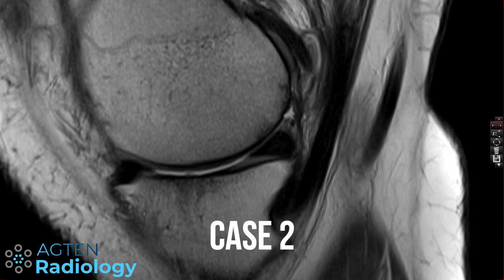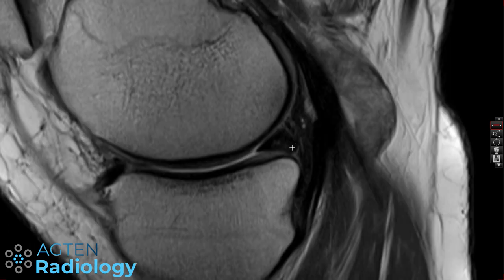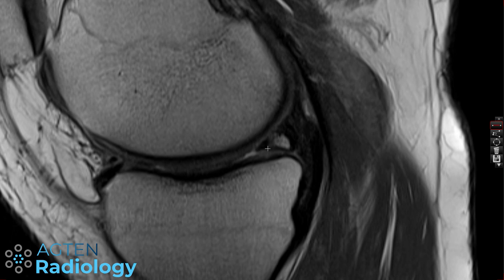So in this second patient, we again are at the level of the medial compartment, and as we scroll centrally, we can see the triangular shape of the medial meniscus, and suddenly we have this change here in this proton density weighted sequence. Now you might wonder, is this a tear? Is this a ganglion cyst? What is it? Is it a ghost sign?